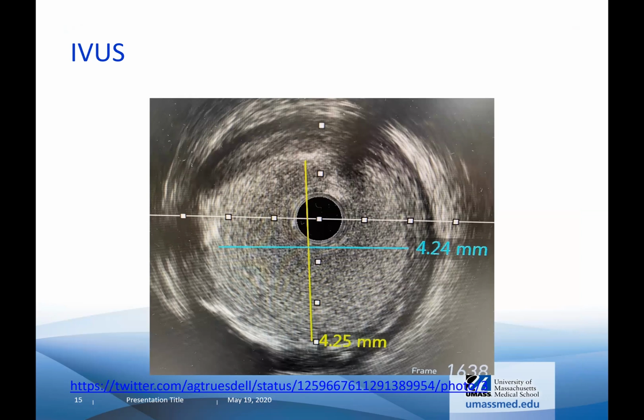Okay, now balloons and stents are over. Now I'm gonna talk about the other stuff which we use, which, as the nurses say, are toys that we use. One of them is intravascular ultrasound. Big technology. The only technology that has been shown to decrease target vessel failure, what we call TVF, or TVR, target vessel revascularization rates.